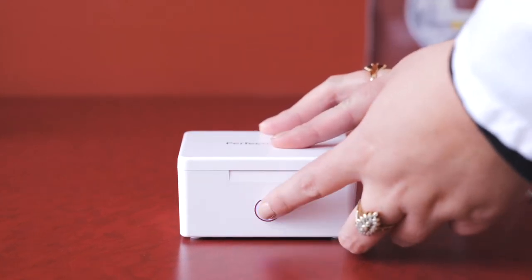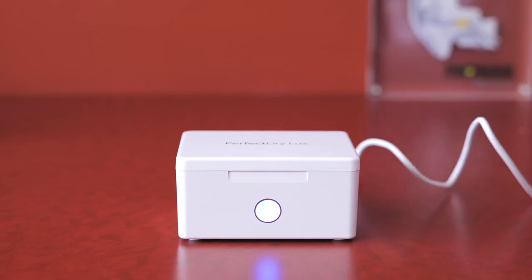Some dehumidifiers also utilize UV lights that have a sanitizing effect. One last way to protect your investment is making sure we always know where they are. We have a saying that if they're not in your ears, they're in the charger or the case. Helping protect your investment is a priority of ours. We want you to have all the tools necessary to facilitate better hearing, better health, and a better quality of life.